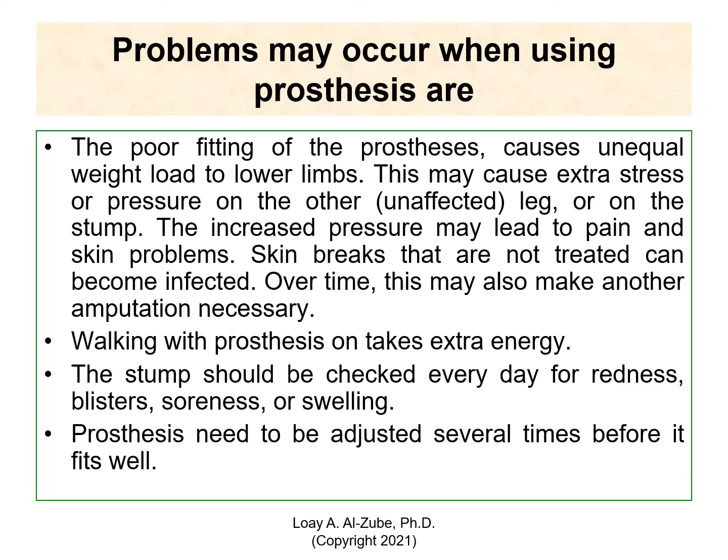Now, how would you check for redness, blistering, soreness, and swelling? You can check physically, but I like to use technology. If I want to check for redness, the infrared cameras that we use for heat mapping. If there is redness in the body, it means there's a lot of blood circulating there. The temperature will go up. So you can actually do this.